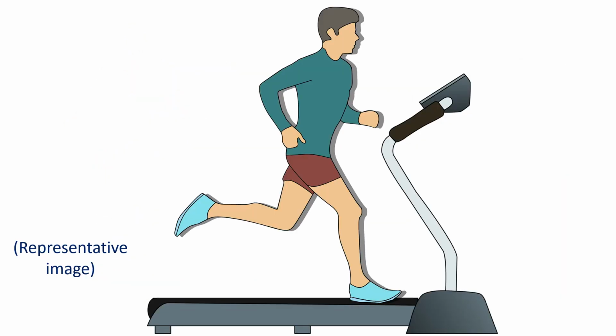An advantage of treadmill is that most people are familiar with walking or running, including young children. But exercise on a treadmill is not a natural form of walking or running for a person not familiar with exercise on a moving surface. Hence, time for practice on the treadmill should be provided before testing.